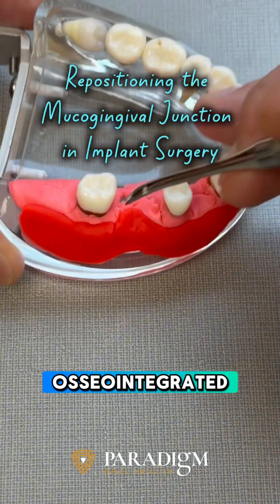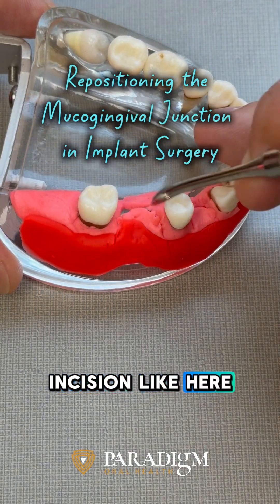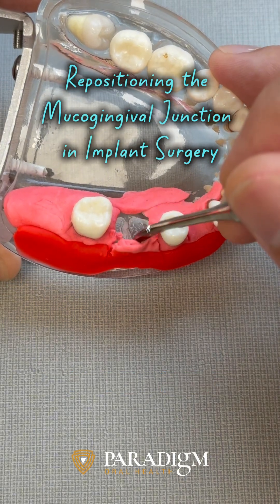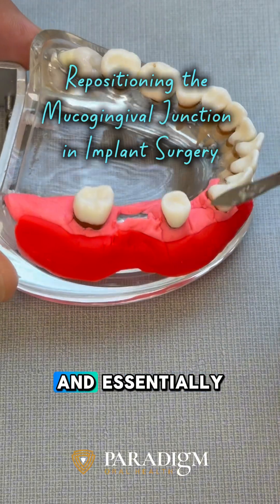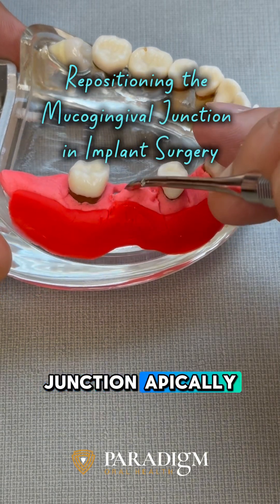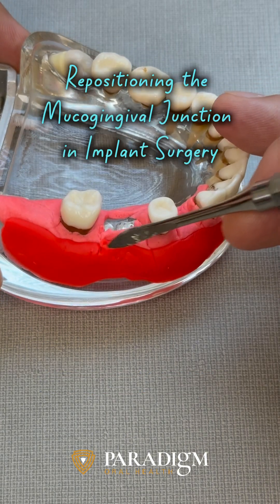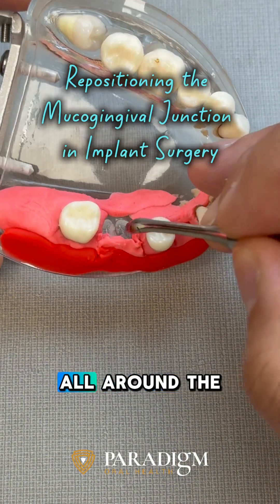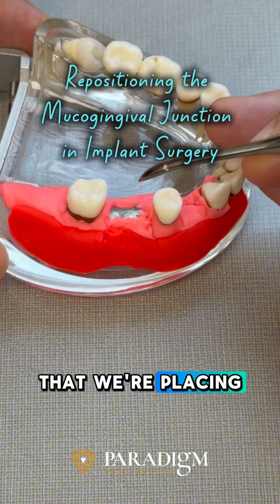Once the implant is osseointegrated, I make a similar incision here and here, then place a healing abutment and essentially reposition this mucogingival junction apically to allow an adequate amount of attached gingiva all around the healing abutment that we're placing here.